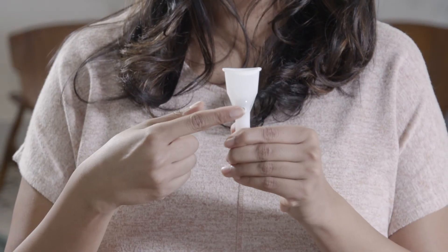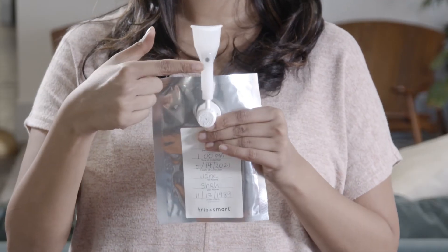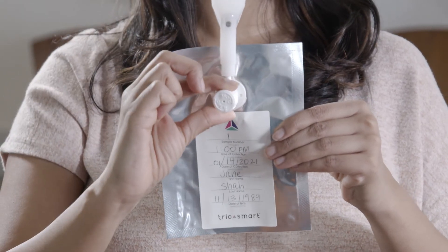Now take the mouthpiece and locate the small hole. Slide the mouthpiece onto the valve making sure it fits snugly and the small hole is on top. Turn the cap on the valve counterclockwise to open it.